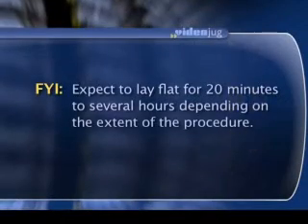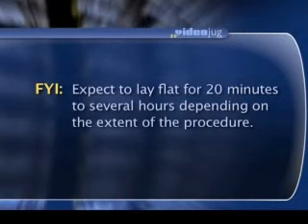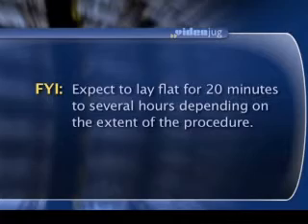After that, your radiologist will place the catheter into the blood vessel and inject iodine dye in the appropriate locations in order to see the blood vessels of interest.